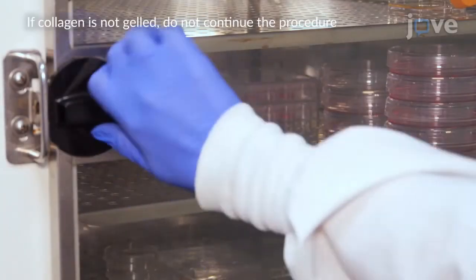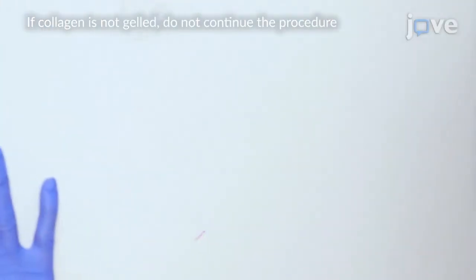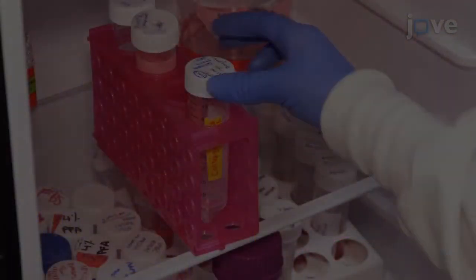After the gelation period, take the 12-well plate of acellular collagen out of the incubator. Remove the 1.7 milliliter capped tube from wet ice, then remove the stock collagen.